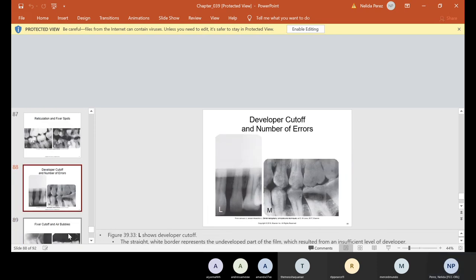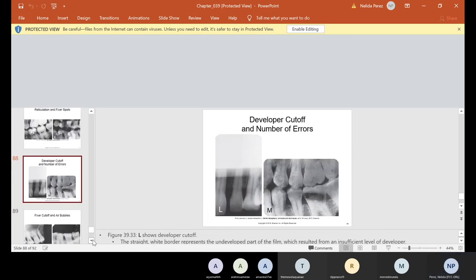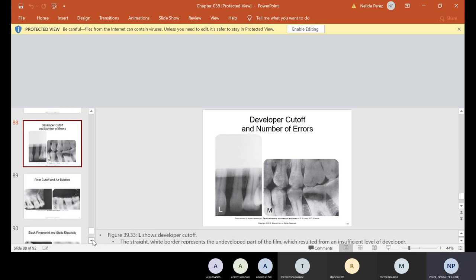On this next set, film M is a bite-wing and film L is maxillary anterior. Easy to identify: vertical versus horizontal — anterior is vertical and posterior is horizontal. Remember: when we're looking at it, the white side of the film packet faces toward the tube head. You look through the target ring and make sure it's white. These are two more ways to distinguish if it's anterior or posterior and maxillary versus mandibular.